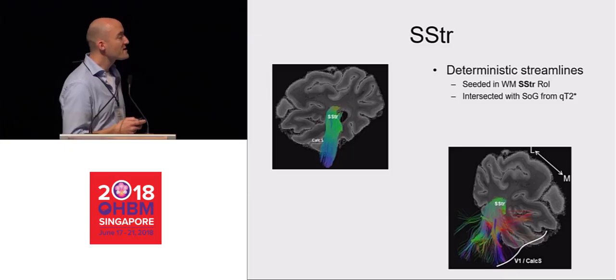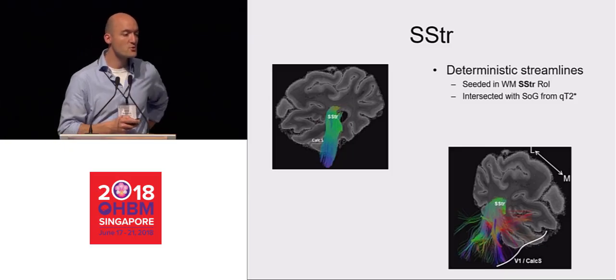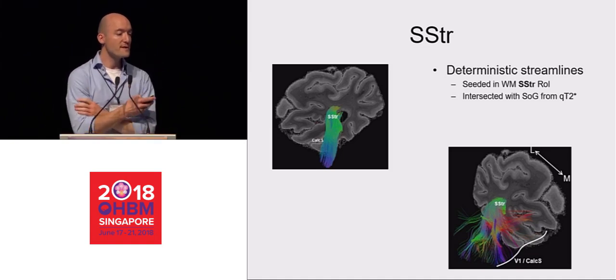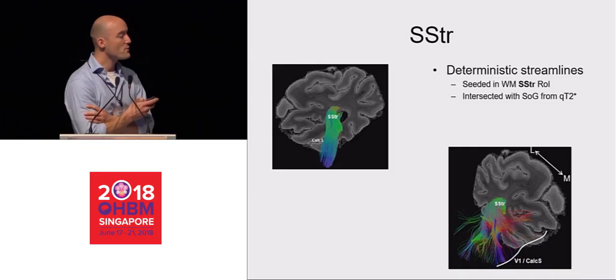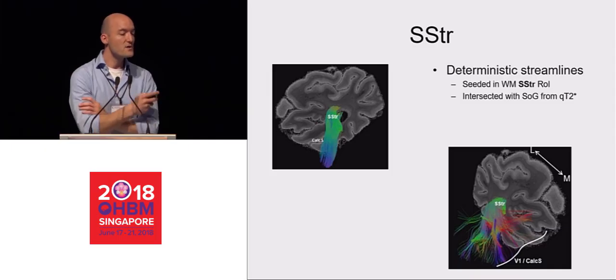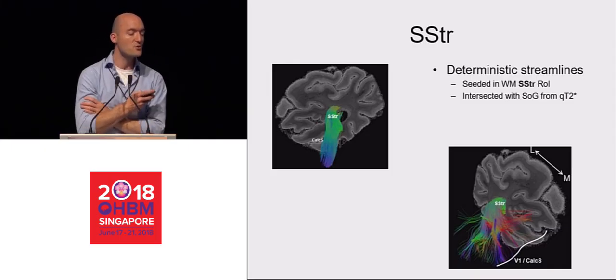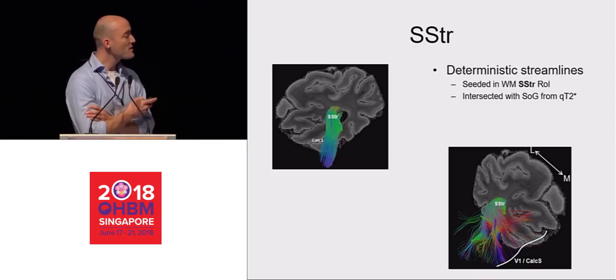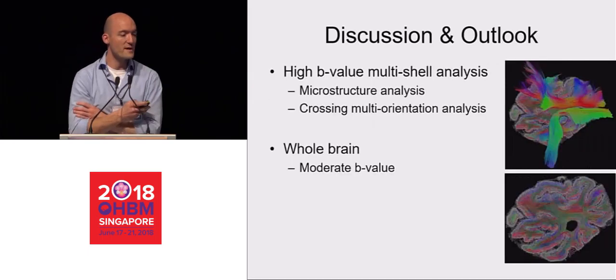Now, a bit more tentatively, we also did some tractography of the sagittal stratum and also the tapetum, where you can see that not only does it course through white matter in a different way next to the lateral ventricle there, but it also terminates very differently in early visual areas. Not everything is known about the sagittal stratum and tapetum connections to early visual areas in human, but at least tentatively it's known that it's much more sparsely connected, especially to V1, and it tends to connect more to the borders of V1 and V2 and the borders of the visual areas at the vertical meridian. And you kind of see that indicated there at the lower right.